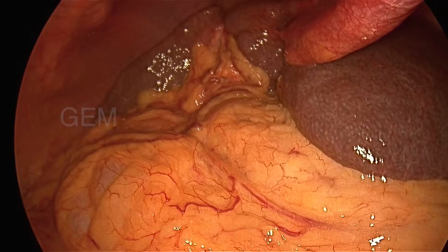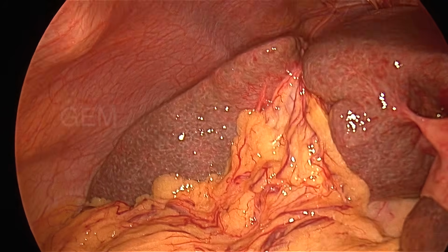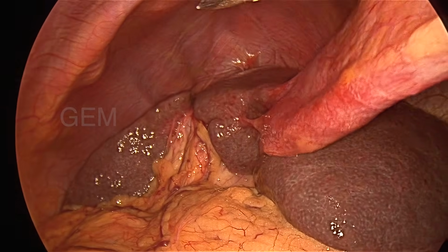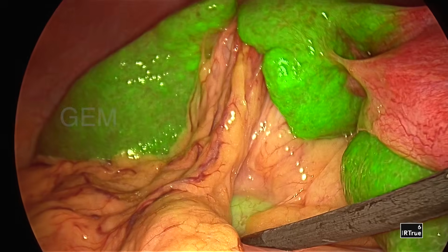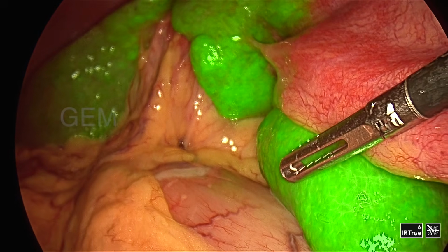So this is the case of chronic contracted cholecystitis. You can see it is a very small contracted gallbladder, and the MRI of this patient shows the stone is in the cystic duct at the CBD junction. So it is very close to the CBD. A long cystic duct is going close to the CBD, and then the stone is obstructing there.